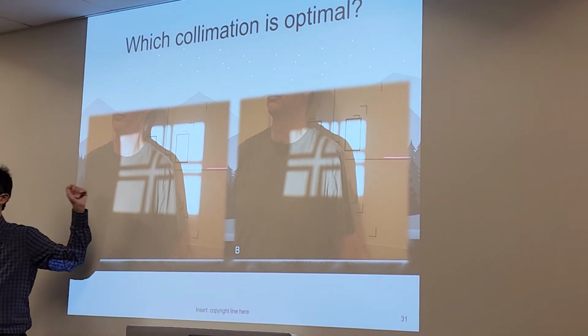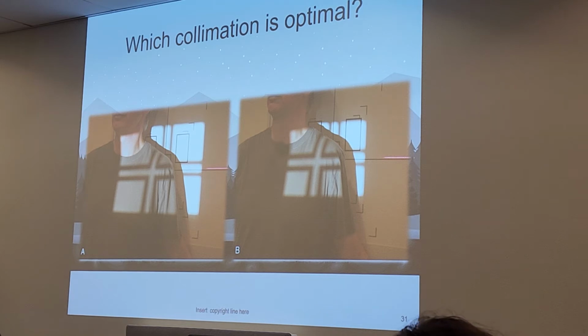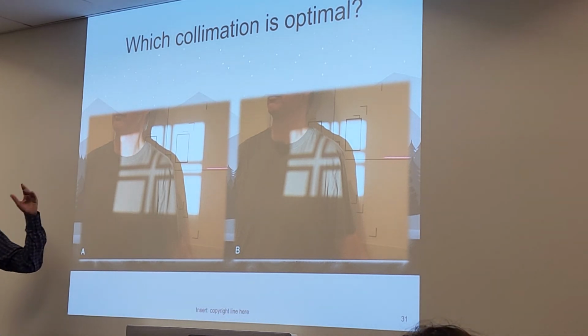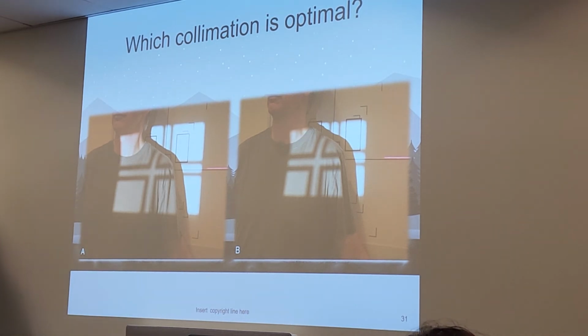Those are all things we are looking for in that shoulder X-ray. But we are not looking for the spine, the chin, or anything else. So that is why you will collimate to only the area of interest. Show only the things you need to see, and do not show the things you do not need to see.